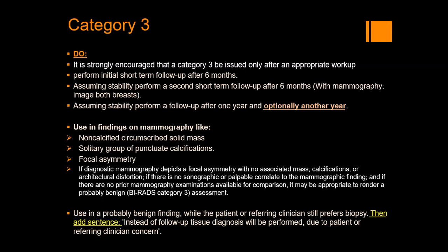Use in findings on mammography, as we described before: non-calcified circumscribed mass, solitary group of punctate calcifications, and focal asymmetry. Regarding focal asymmetry, we said if diagnostic mammography depicts a focal asymmetry with no associated mass, no associated calcification, no associated distortion, no associated suspicious features, and there is no sonographic or palpable correlate, in this case you can report it as BIRADS 3, probably benign, findings for follow-up.